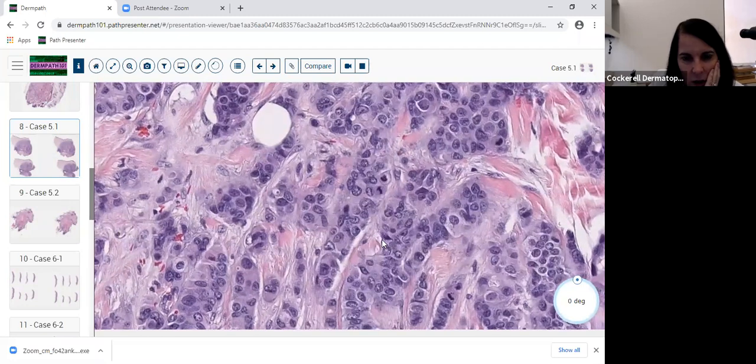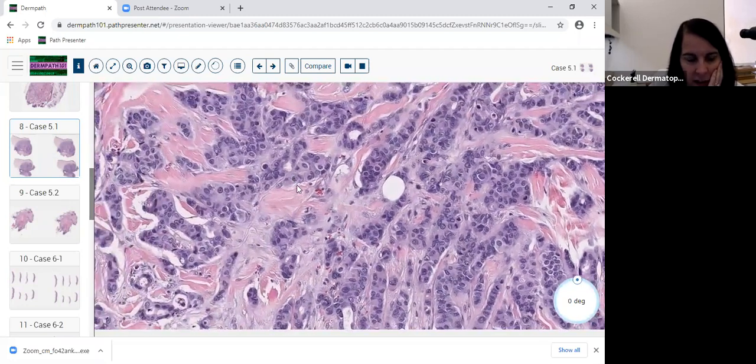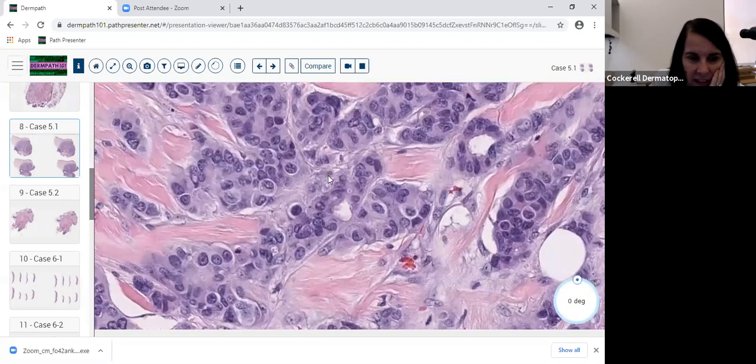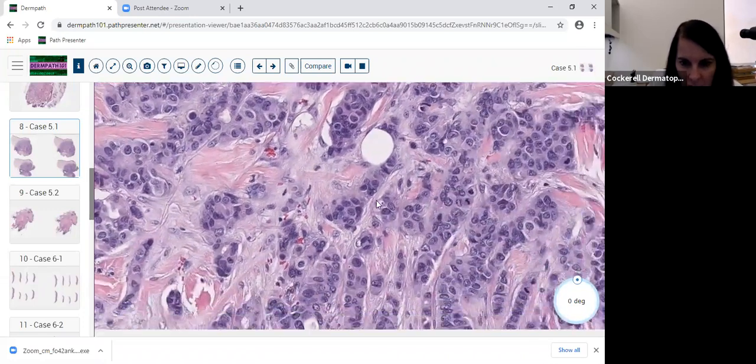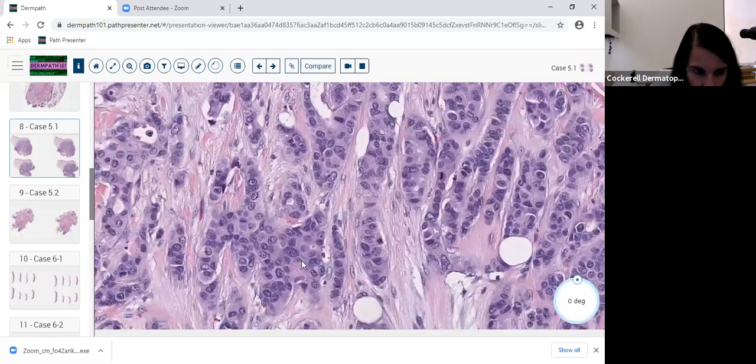And this looks like a carcinoma. It does not look like a sarcoma because it's not spindled. It doesn't look like a lymphoma because these cells have too much cytoplasm. This doesn't look like any lymphoma I can think of. First of all, lymphomas don't form glands. So the minute you start seeing the glands, that's why you really have to look around and look for differentiation when you get a tumor like this, some kind of differentiation.